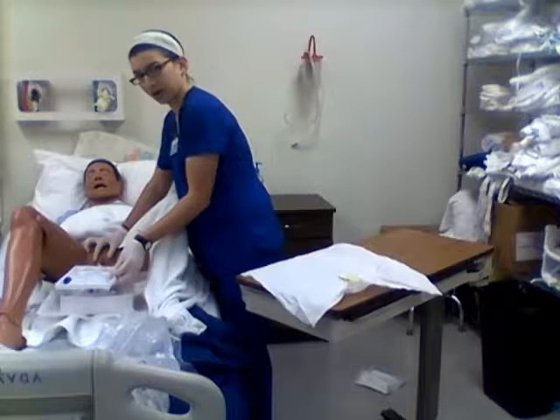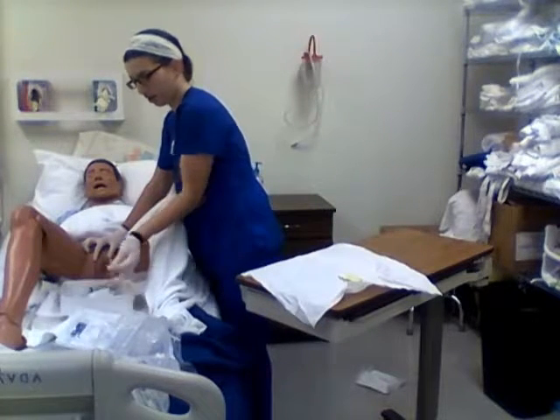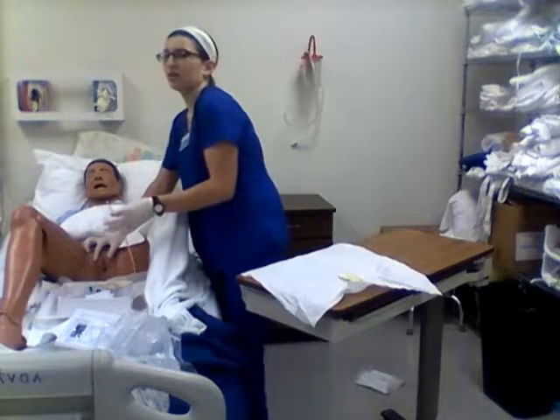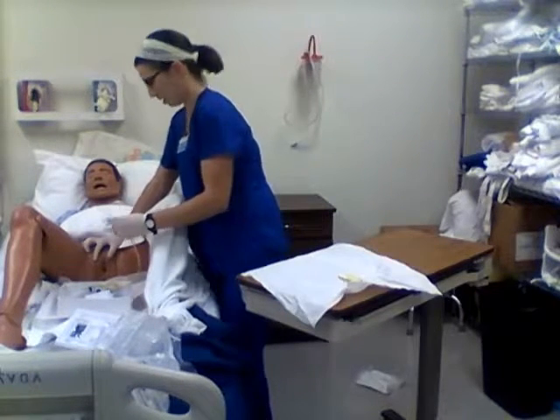I can get rid of my top part because I'm no longer going to need this. And once I do, it's no longer sterile, so I can't do anything with it. So now I can go ahead, I can put the catheter in the patient. I'm going to insert it about 2 to 3 inches until I see a urine return. Then I'm going to insert it again another inch.